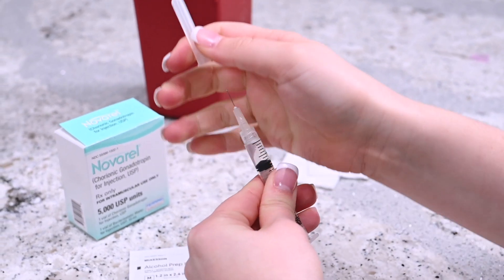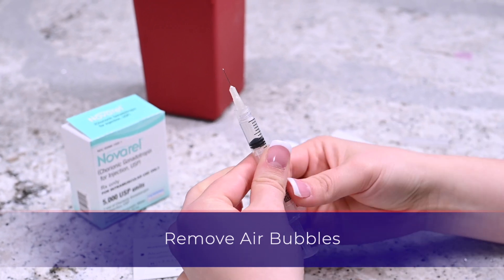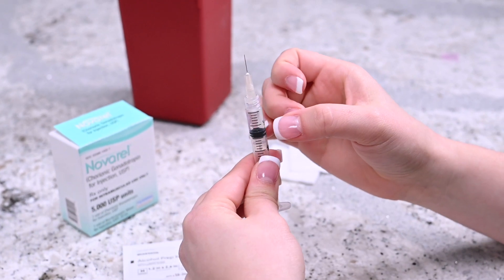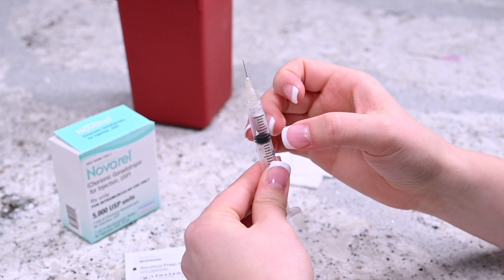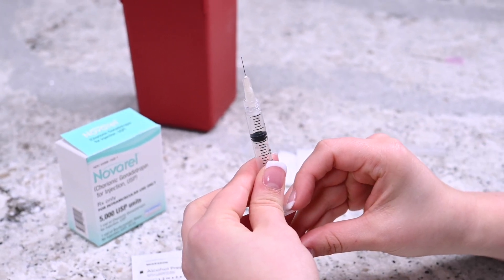Don't let the needle touch anything, including your hands. While holding the needle upright, gently tap the side of the syringe until the air bubbles migrate to the top. Apply slight pressure on the plunger until a drop of liquid appears at the tip of the needle.